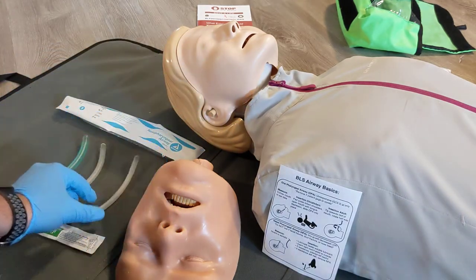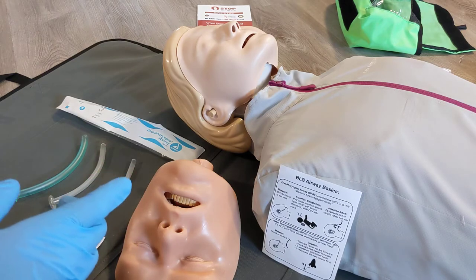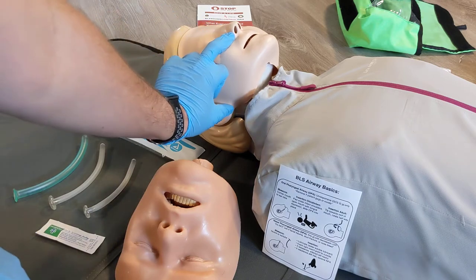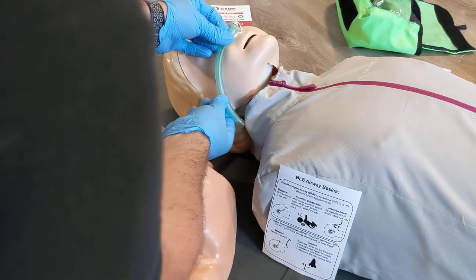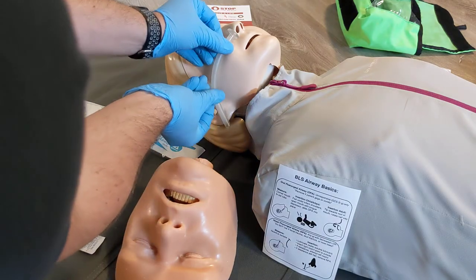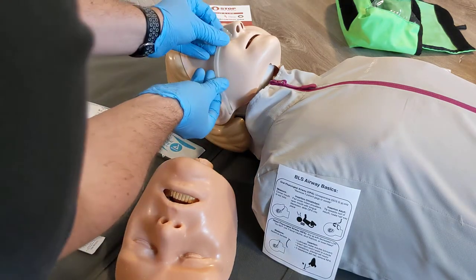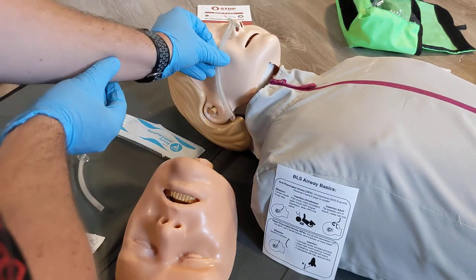They come in multiple sizes and you need to size them to the patient. To size a nasal pharyngeal airway, you're going to line it up between the nose and the earlobe. We can take our airway here — nose to earlobe — and we can see that's a bit long, so we'll try the next size. That one's pretty good; the other might be a bit short, so we're going to go with this one.